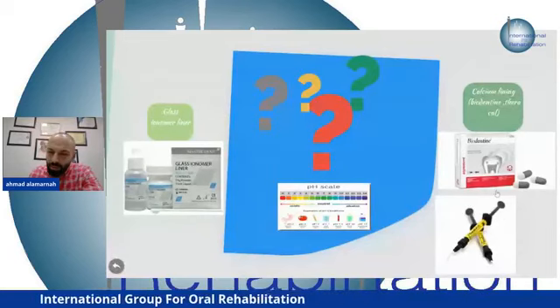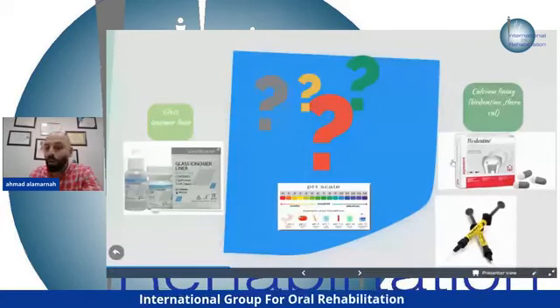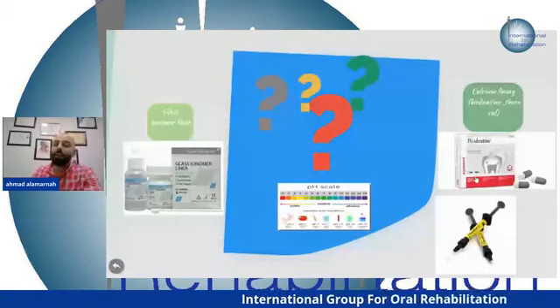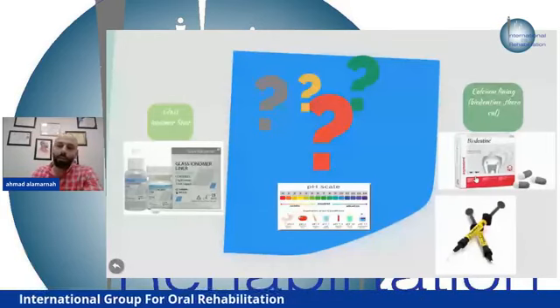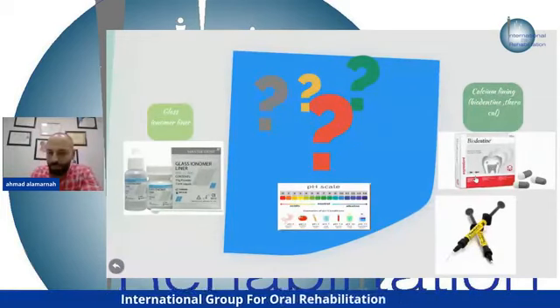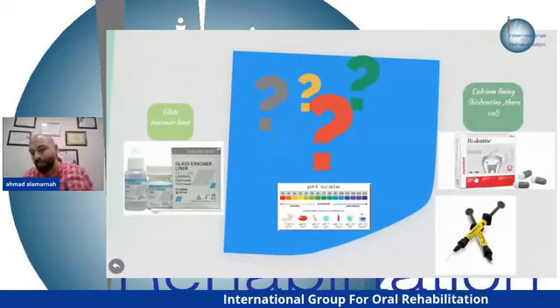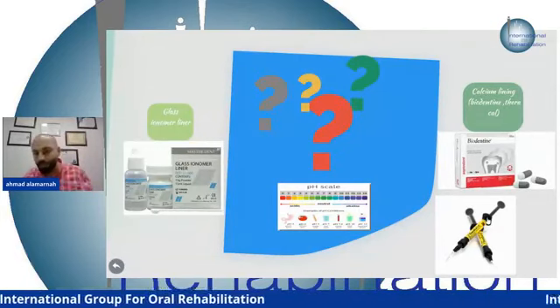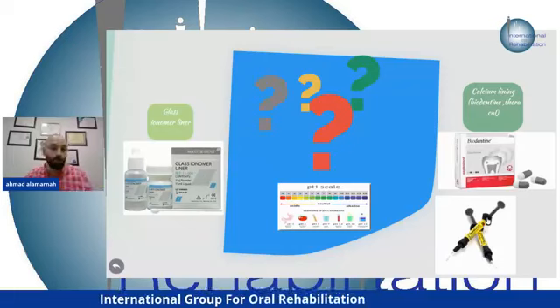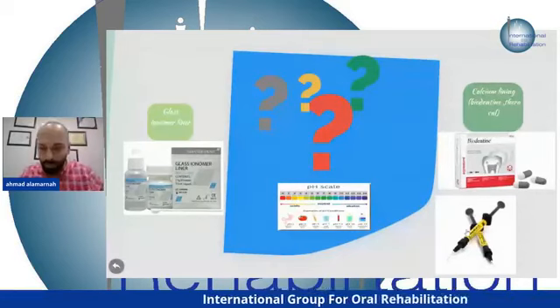But I do prefer the Theracal over the Biodentine, because with Biodentine you have to use the whole capsule one time. The patient comes in the first session, you place the Biodentine as a whole restoration. Then after 48 hours they return, and you remove 2 to 4 millimeters from the restoration and place the composite on top after the setting is 100%. But the Theracal, you can use whenever you need it, and you can continue your restoration at the same time. And you have control over the quantity that you use. You can use a drop, you can use the whole syringe, anything you want.